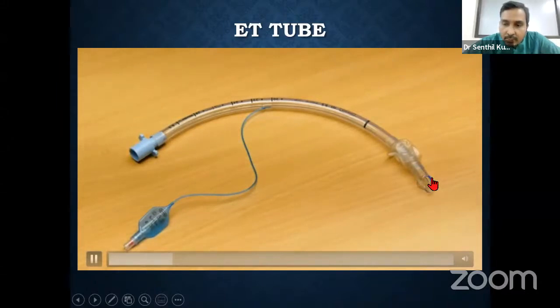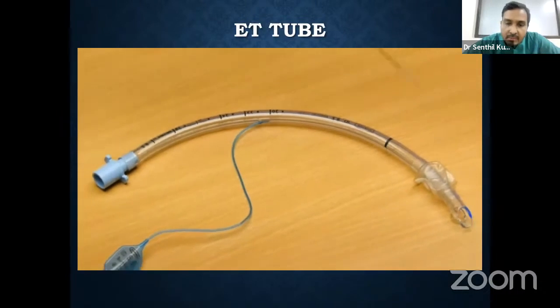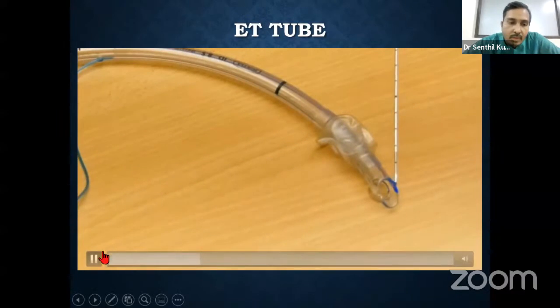That is, the first one is the bevel. See, first thing, why is there a bevel? Instead of a bevel, if you have a cylindrical cut tube, what are the problems? So the bevel is very important for two things, because the cylindrical tube will face some difficulty when we intubate for entering into the narrow vocal cord. That's why the bevel is there. Since it is a tapered edge, it is going to help us for easy facilitation of the intubation.